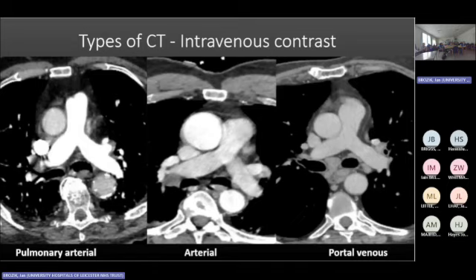What do you suspect? What do you want to really rule out? And we'll protocol it accordingly in order to try to answer your clinical question. Obviously, we cannot avoid it every single time. So there are situations when we're using the wrong protocol. We need to recall the patient, or the images might be sufficient to make the diagnosis.